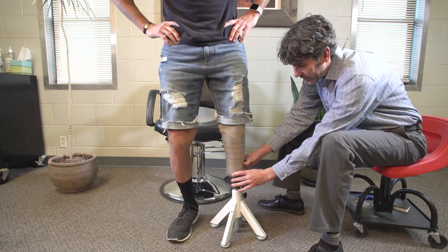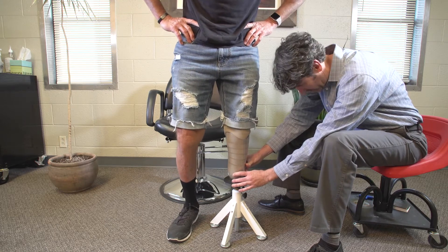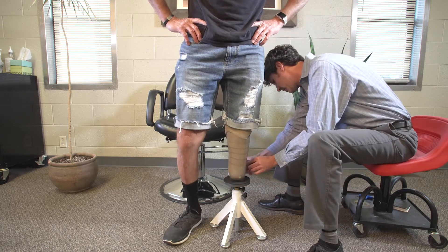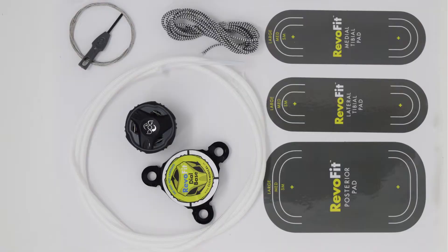RevoFit adjustability works best on sockets that fit properly, and it's not meant to compensate for an ill-fitting socket. So make sure your check socket fits well before adding RevoFit. As a part of this educational course, CLICK provides a check socket kit with tools to make your first RevoFit check socket easy to build.